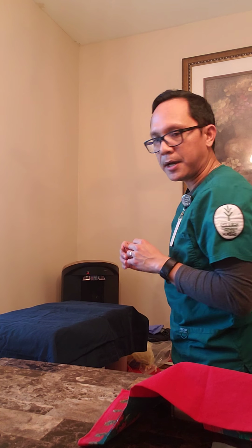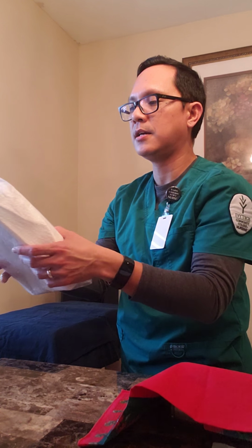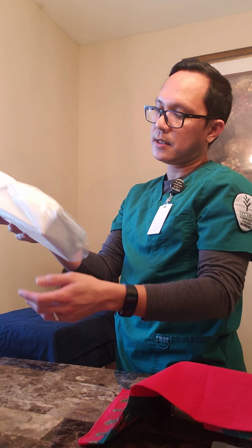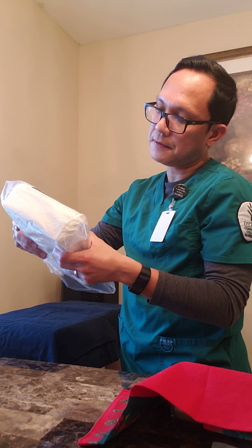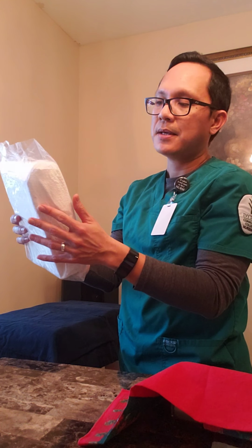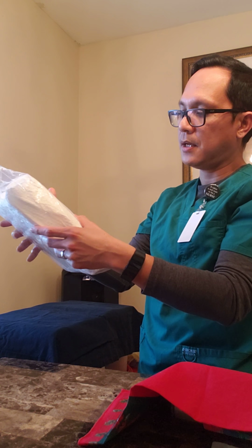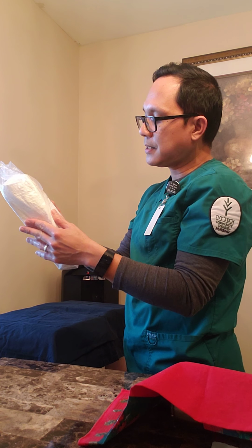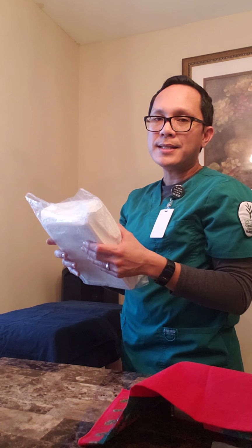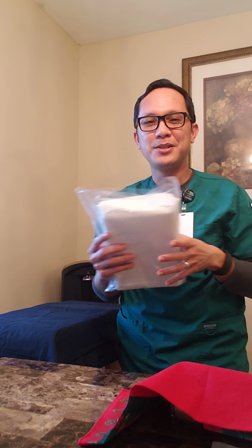I'm going to get the Foley from the storage area, from the clean utility area. Once I get the Foley, I want to make sure I have the correct size. I want to make sure the bag is not open or doesn't have any tears in it, especially since the Foley is a sterile kit, and check the expiration date, just to make sure that the kit is not expired at all. Once I have all the documents and equipment, I'm going to go back to my patient's room.